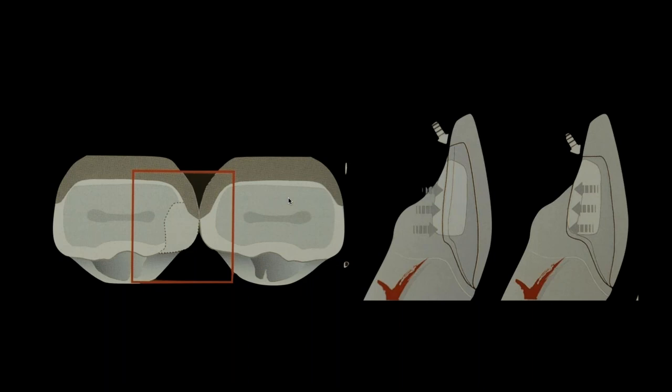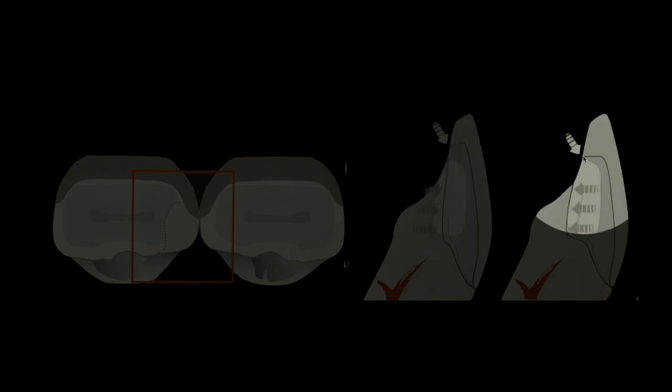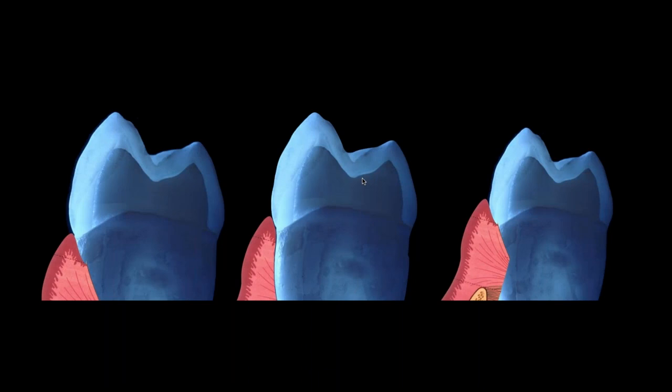The other challenge here is that when we talked about before, I said I want that 2 millimeter of reduction. I also want you to be careful about where the functional attributes are here. If your lower incisal edge is hitting right where your junction is, that's not really an ideal scenario for a veneer. You might want to consider going full coverage. I don't want to be hitting right in the joints where my finish lines are. So you need to also take that into account when you're working your way through your cases.